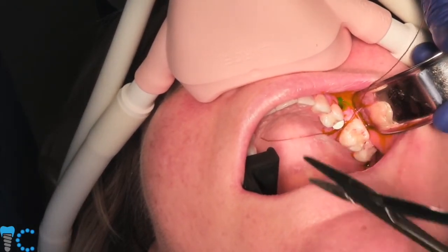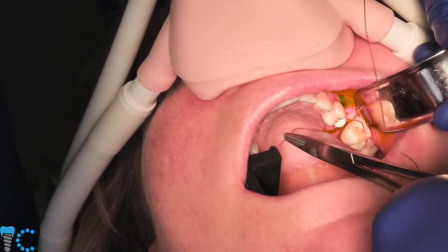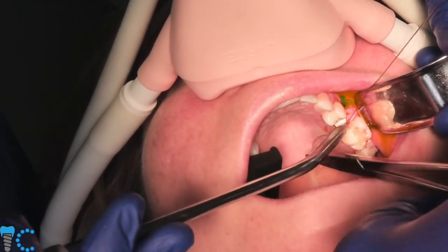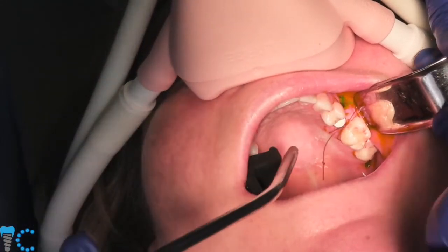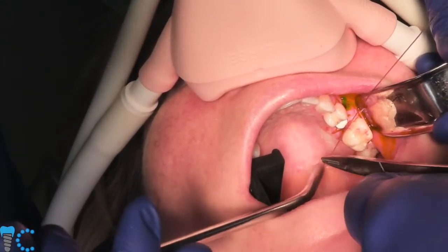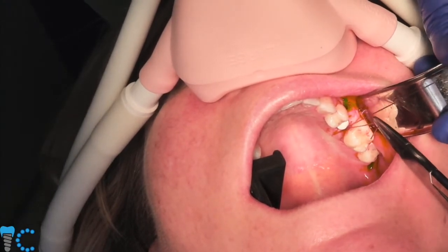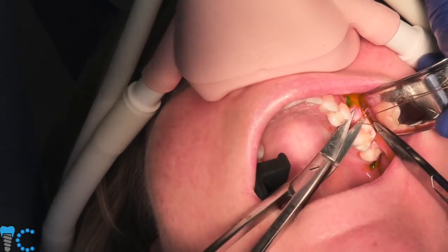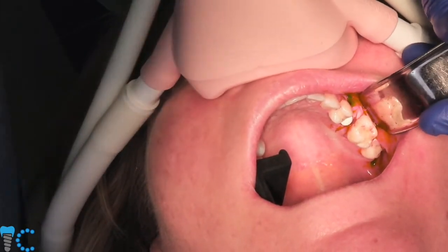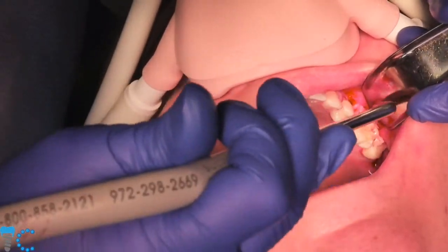We don't want to have to take them out, and the patients like it when we don't have to take their sutures out. If they come back a week or two post-op and their sutures are still in, then the next question is, are those sutures doing anything useful? Are they loose and accumulating plaque, or are they still holding some inflamed tissue in place and doing something constructive? And based on that, we'll make a decision on whether we want to take them out or not.